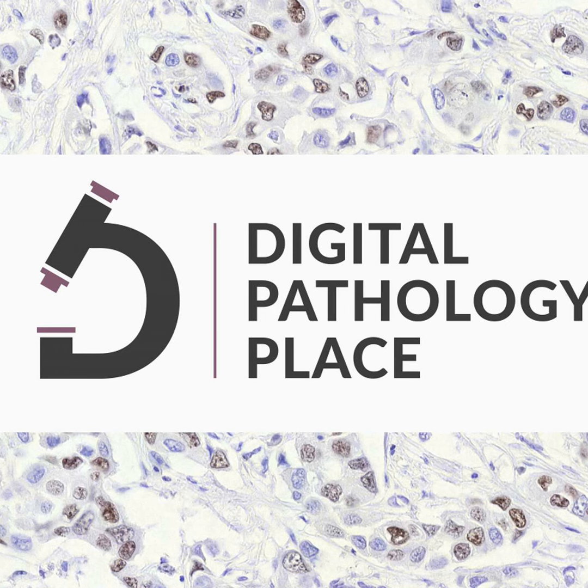So you mentioned the actual name of the system, and this will become important in a moment. It's called Roche Digital Pathology DX, or we abbreviate it RDPD sometimes. So if you hear me say RDPD during our chat today, you'll know what I'm talking about. We'll go into this in a bit of detail for the listeners who aren't familiar with it. The system, according to the FDA, has three basic components: a scanner component, a software viewer component, and then a display monitor component.